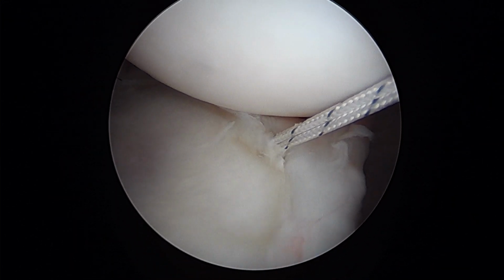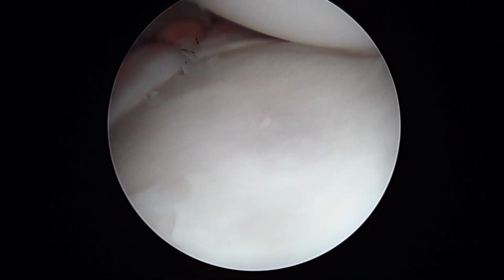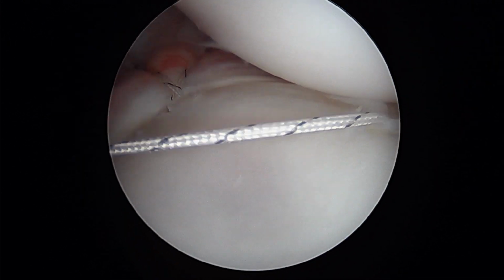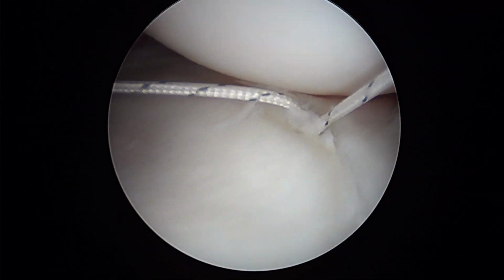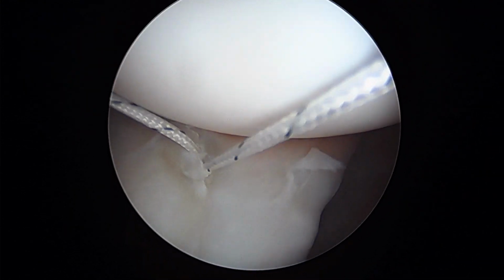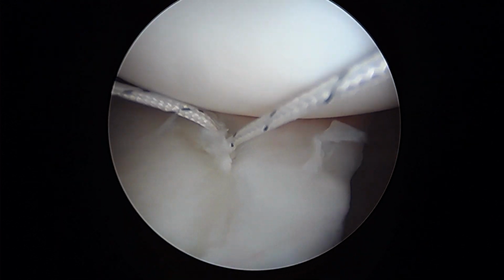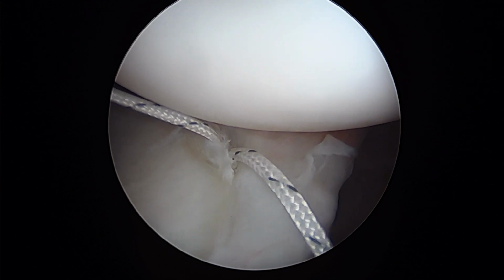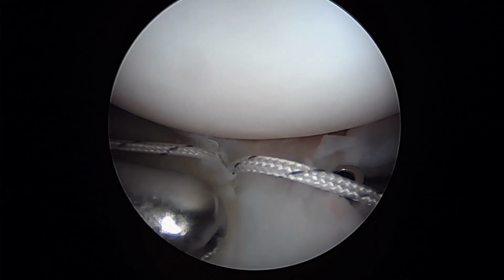Okay, so there's suture number 2. It's very solid. Just like before, we're going to reach in and shuttle the suture. So there's one right there going out the back now. Now we're going to put a grasper in the back and take a turn to the left, suture hook in the front. We're going to tighten up this ligament there. You can relax. So put that there and then turn to the left to me. So I'll show you what the turn to the left looks like. Looks like that. Pull that back, please.